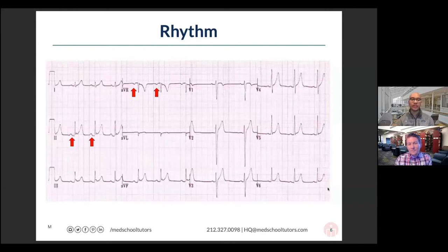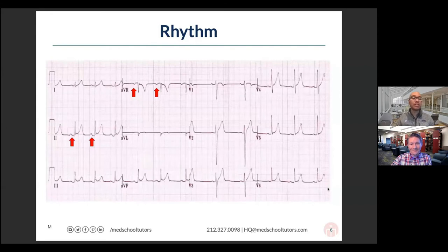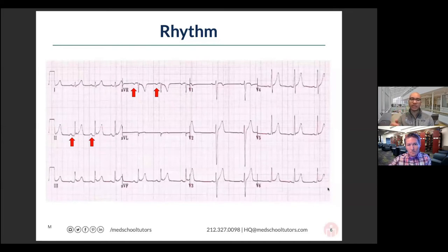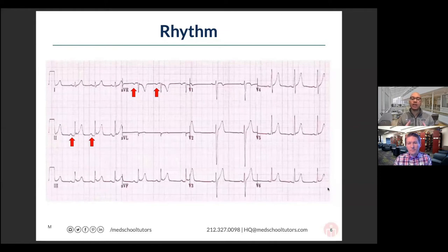Next is rhythm. When looking at the rhythm, the language used is: regular, irregular, regularly irregular, or irregularly irregular. In a normal heart, the impulse starts in the sinoatrial node, travels through the atria, pauses at the AV node, then goes down the bundle of His and the Purkinje system, depolarizing the ventricles. We expect a P wave before every QRS — atrial activity propagating through the heart followed by ventricular activity. Sometimes signals from the atria aren't coming from the SA node; they're from ectopic foci or other locations.